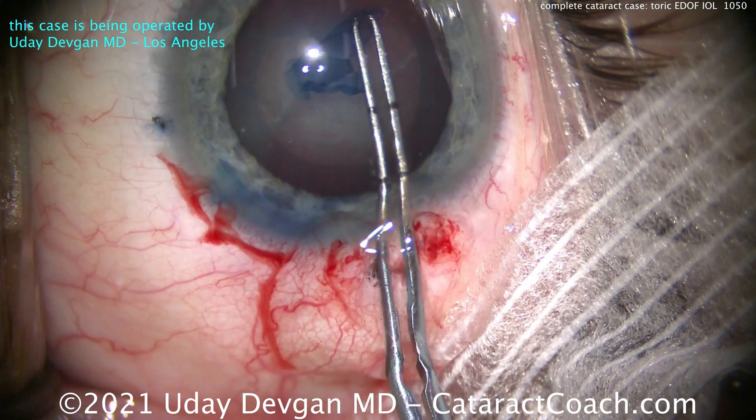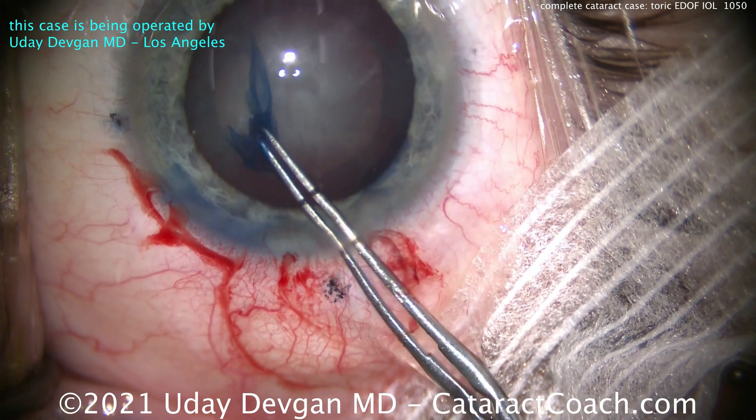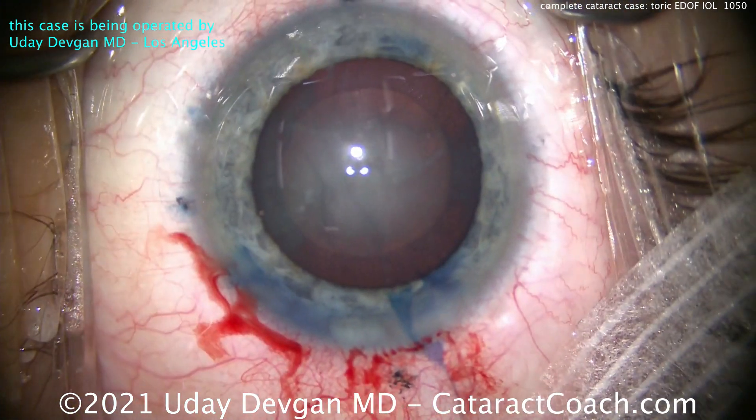It's a little off our screen here — remember my microscope view is much bigger than the video. There's the finished rhexis — it looks beautiful. Let's measure it: it's exactly five millimeters. That looks great.